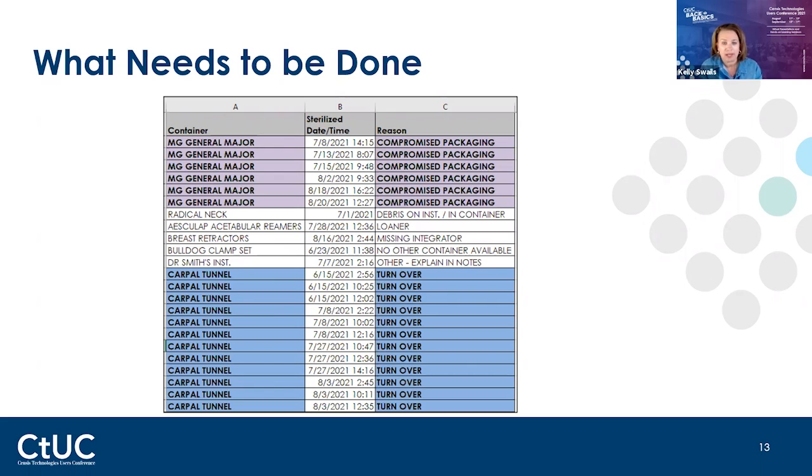And if we're having to flash for IUSS, 3, 4, 5 times a month, we'll then go look and do that analysis. How many do we have on the shelf? And what is the typical schedule? It could be that maybe when the surgeon's here on their block day, it's fine because they're the only one.